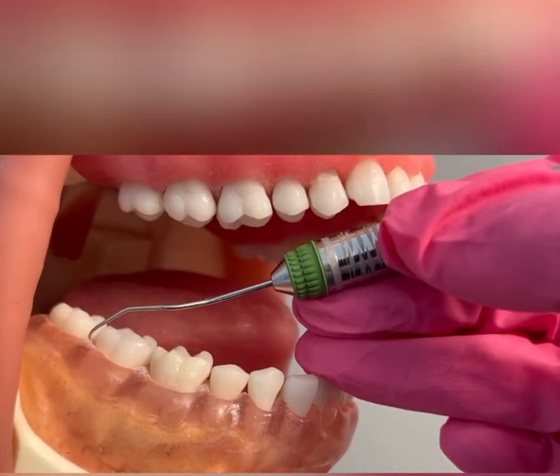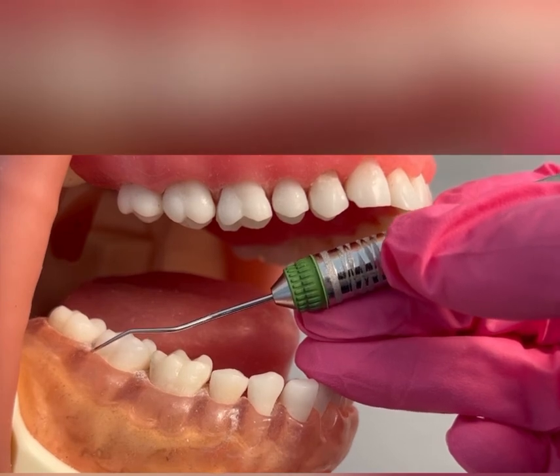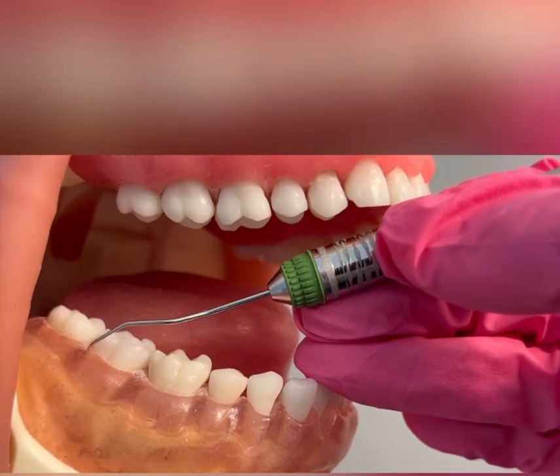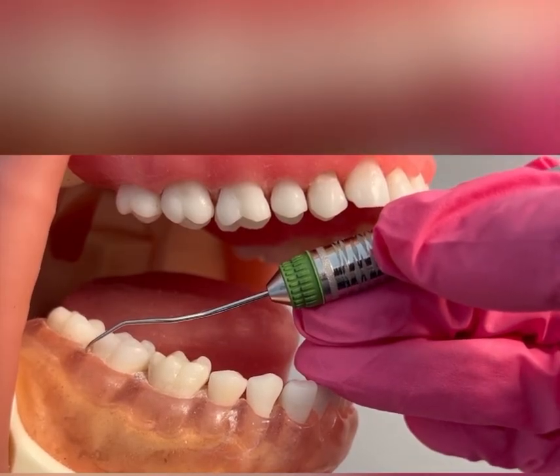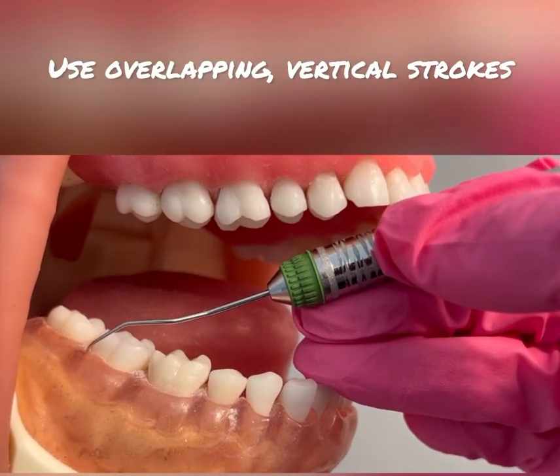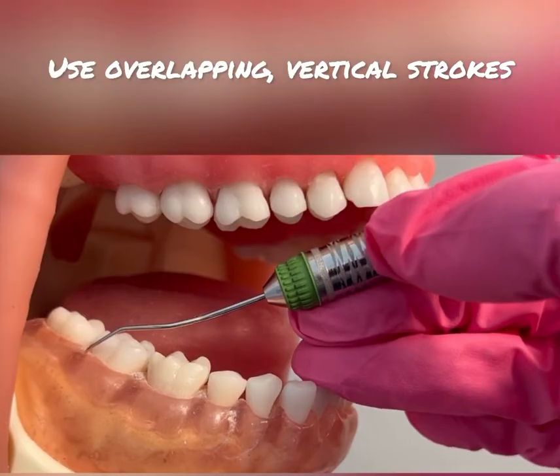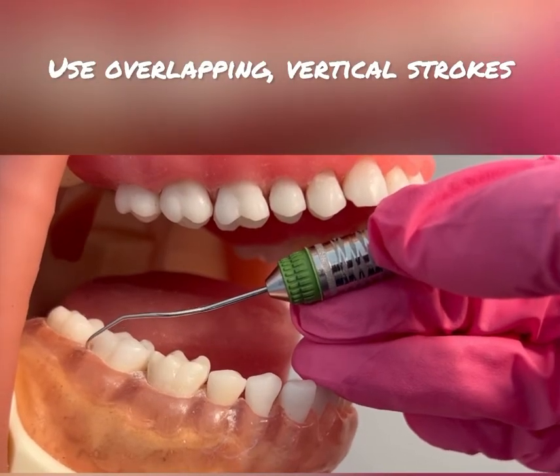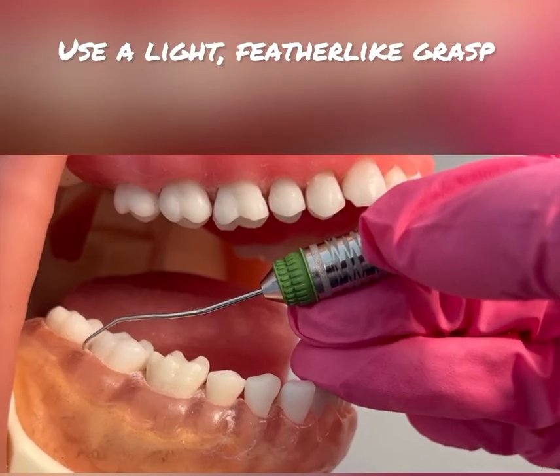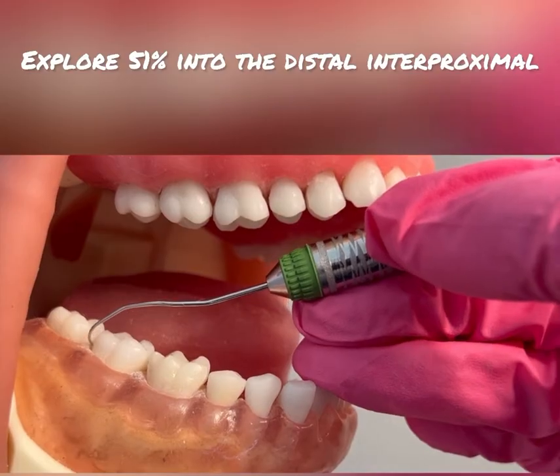I'm going to start at the distal buccal line angle, adapting only one to two millimeters of that working end. I'm going to insert subgingivally to the base of the pocket, using overlapping vertical strokes with a very light feather-like grasp, working my way into that very distal interproximal.